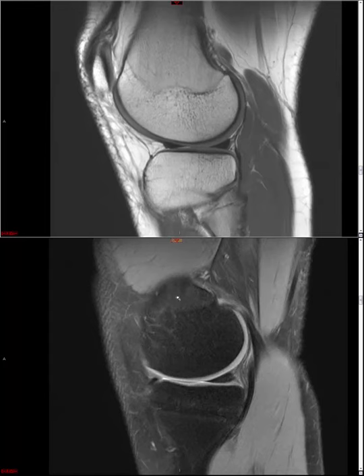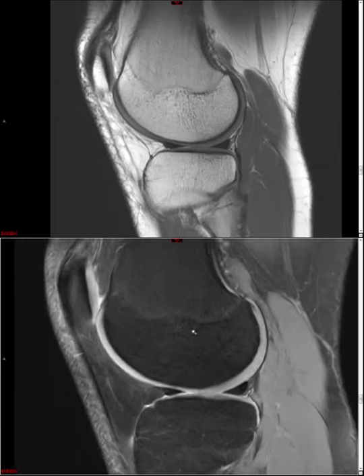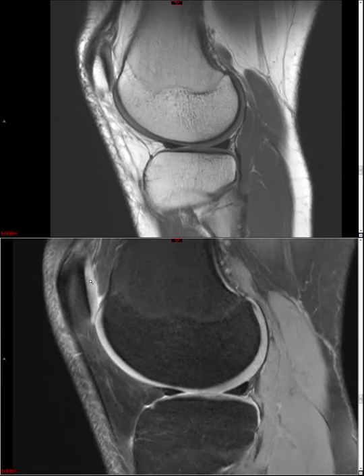Let's see if it shows better on this. No, not really. We'll stick with this. So here's our lateral femoral condyle, here's our convex lateral tibial plateau, and you're going to see a focal flattening. For the lateral condyle, it's about halfway through the condyle that you see this flattening. Parenthetically, this is also where you get the osteochondral impaction injury in a pivot shift injury, the so-called deep sulcus sign of ACL tear. But I also use this point to define the extent of the trochlear or patellofemoral cartilage versus the femoral-tibial cartilage. So that's a dividing point for me.